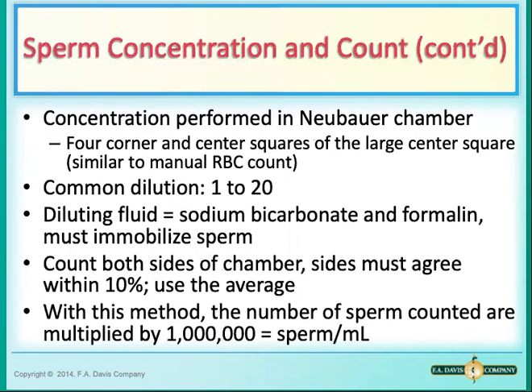All right, so when we are evaluating a semen sample, the sperm concentration is typically performed using a Neubauer counting chamber. The sperm are counted in the same manner as the cells are counted in the CSF analysis. We could dilute the specimen and count the cells in a Neubauer chamber. This is also called a hemocytometer. The amount of the dilution and the number of squares that we count can vary among laboratories, and those are 2 parameters that we have to include in our calculation for our final number.